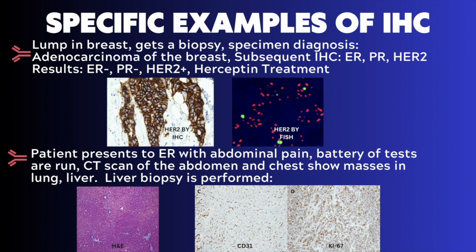The pathologist notices vast changes in the breast tissue that appear to be an invasive tumor. Their initial diagnosis is adenocarcinoma of the breast. That day, the pathologist orders subsequent IHC testing to check the hormone profile of this tumor. Estrogen receptor, progesterone receptor, and HER2/neu markers are ordered in the system. These marker names are commonly shortened to ER, PR, and HER2.